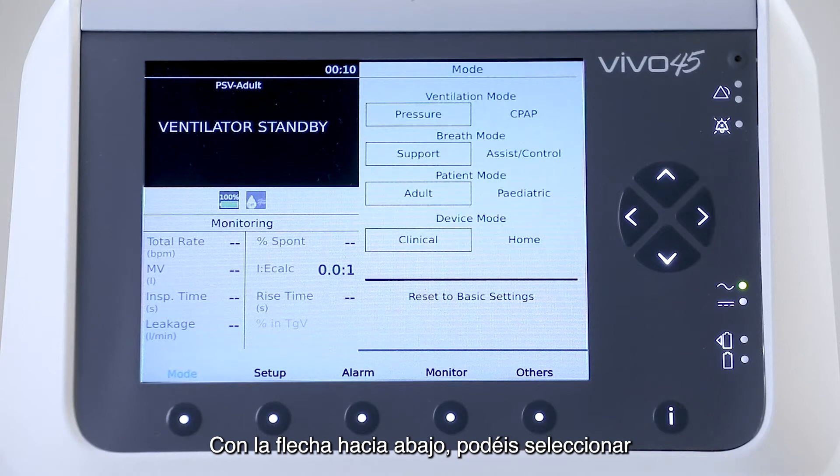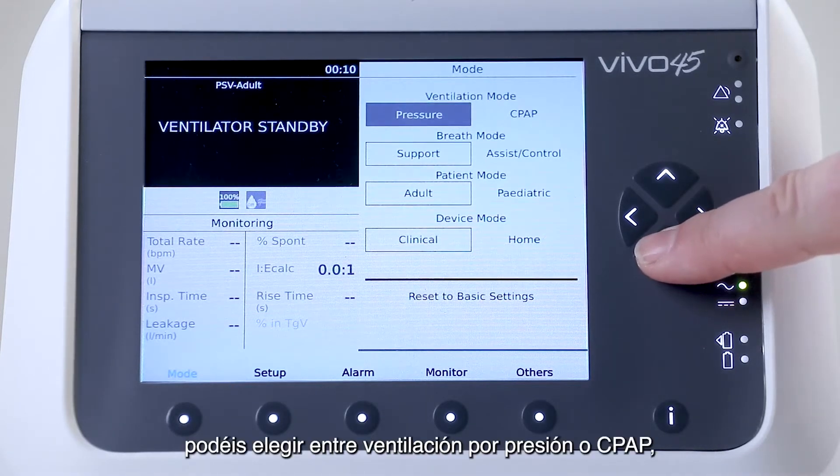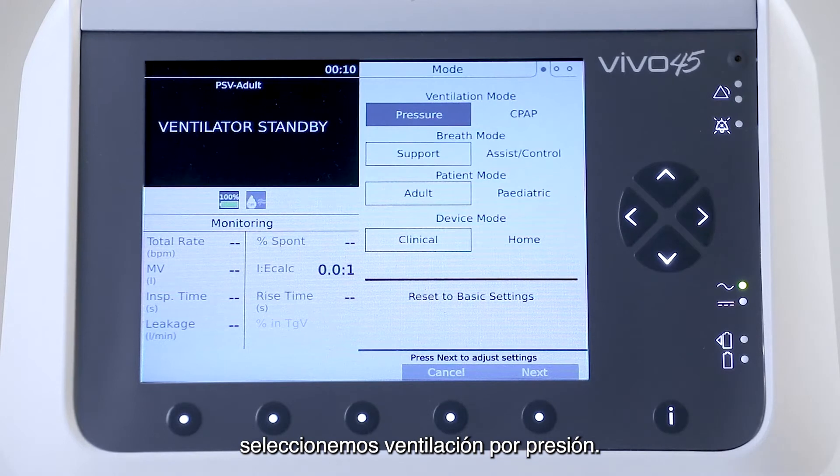With the arrow down, you can select the ventilation mode. In this case, you can choose between pressure ventilation or CPAP. Let's select pressure ventilation.